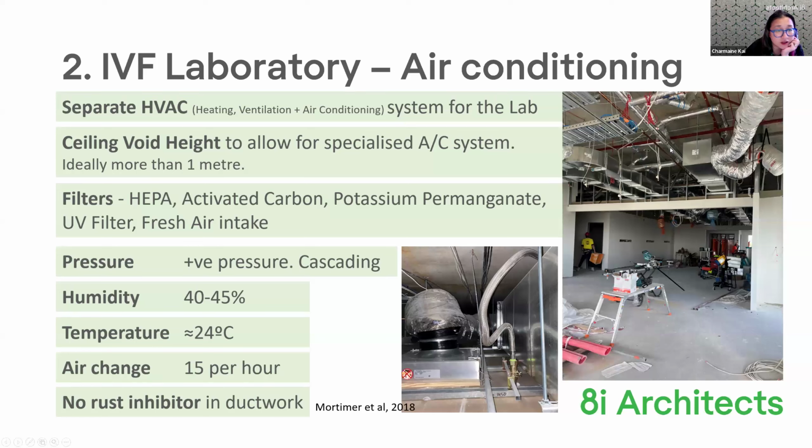the ceiling void, particularly in the photo on the right, is about 1.3, 1.4 meters. So it's quite big, not something you would normally find in most buildings. This building was purpose-built to contain a hospital. So they deliberately designed quite high ceiling spaces, knowing that there'd be a lot of services going through. You can see the amount of ductwork, those rectangular sections through here, they're all rigid air conditioning ducts. We've got plumbing from the floor above.